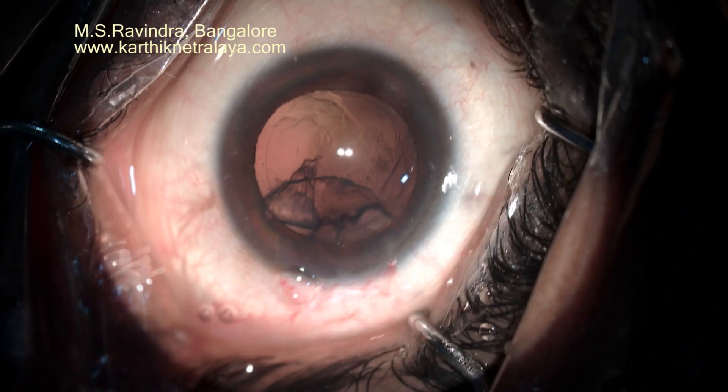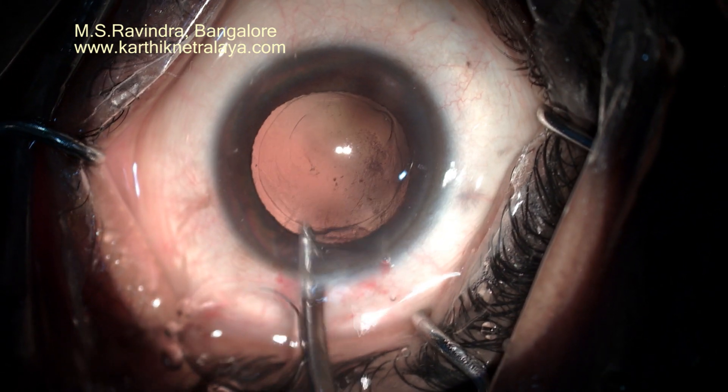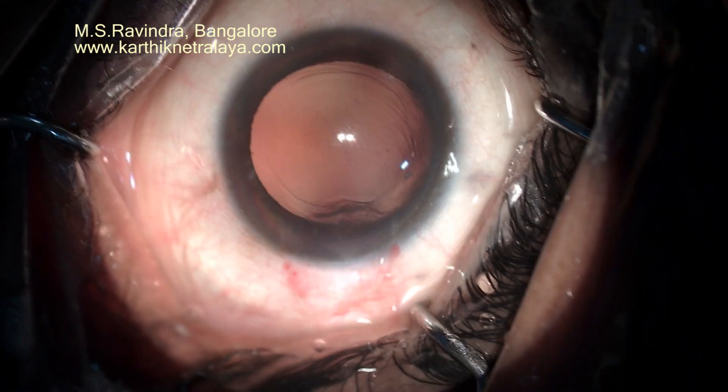There are no side ports. A single tunnel is used to do the cataract surgery. The tunnel is not put into stretch at all. The AC is deepened.